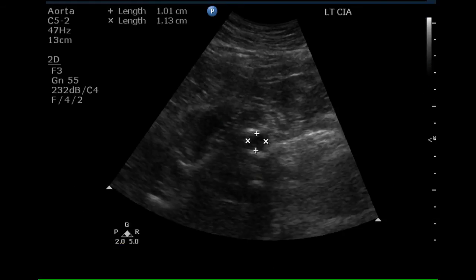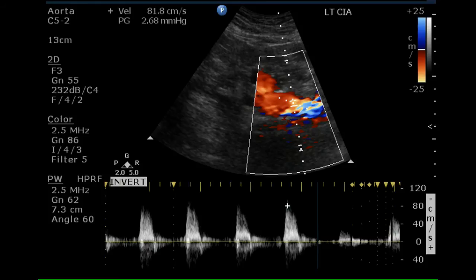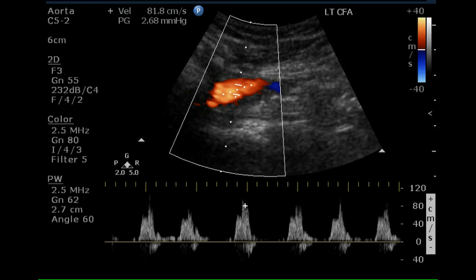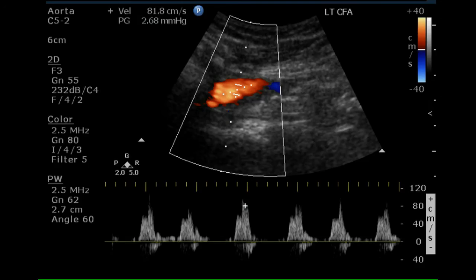The left common iliac artery is normal size, as shown on this transverse image. The pulse Doppler waveform is abnormal and is monophasic. Another pulse Doppler waveform of the left common iliac artery demonstrates a monophasic waveform. The common femoral artery is normal in size and fills with color Doppler, with a monophasic waveform present and turbulence demonstrated below the baseline.